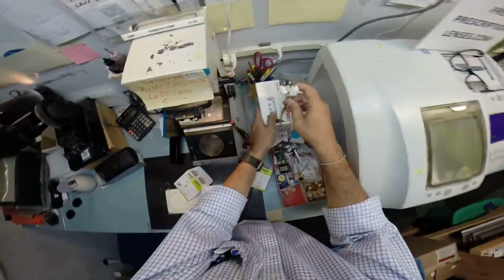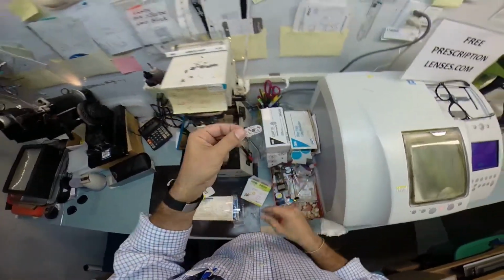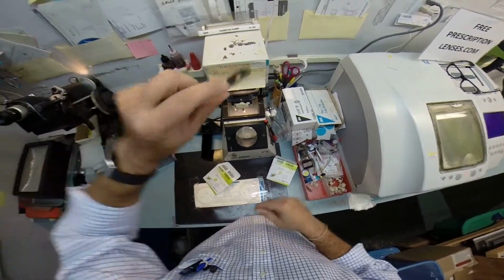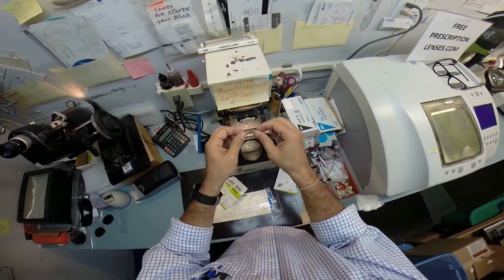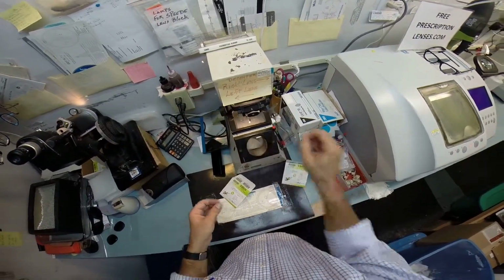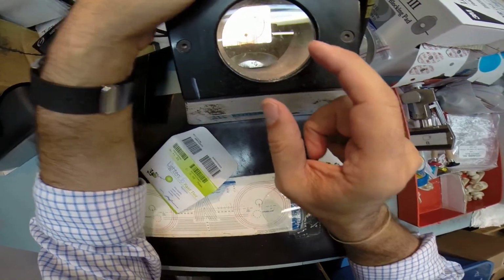And wouldn't you know it, 3M, the same people who make Post-it notes, make a double-sided adhesive sticker, and the black side is the sticky side. So I'm going to stick that onto the block. Let me get the block in there correctly. There we go. Pull away the tape on my side, and essentially what I'm looking into here is an optical crosshair. It's just like a scope.